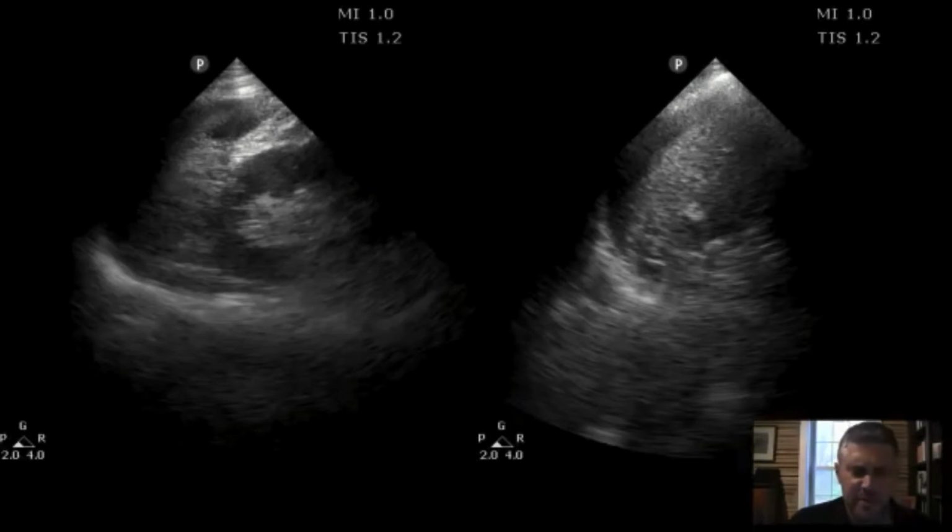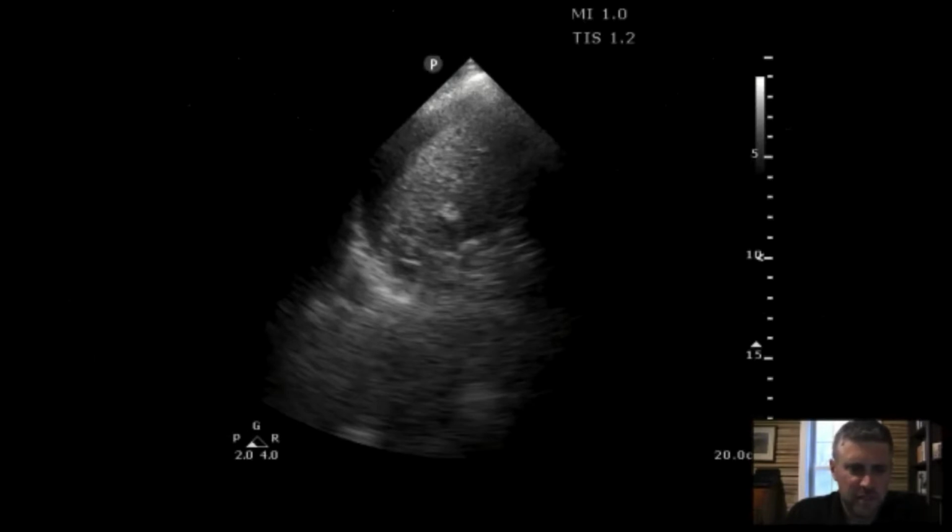In the right image, we see the spleen and the diaphragm that's above it, that bright white line, but there's something interposed between the diaphragm and the spleen, right? There's something dark there. So that's concerning, and we'll focus in on that. In this context, since the patient fell on their left side and has injuries on the left side, that's going to be consistent with free fluid around the patient's spleen. And unlike the right side, where R3 was the most commonly seen place, the subphrenic space on the left side is one of the most common places to see fluid in the left upper quadrant, right?